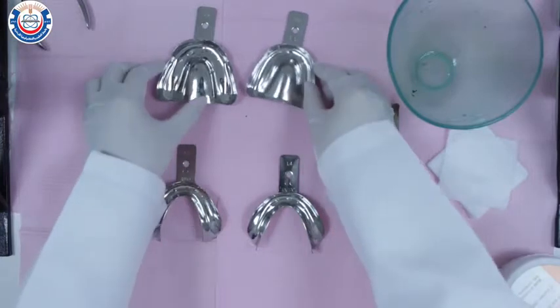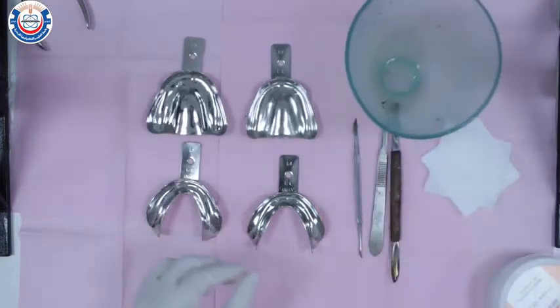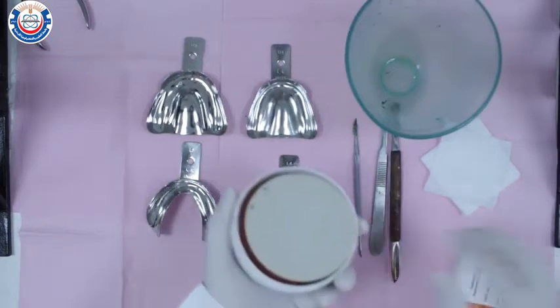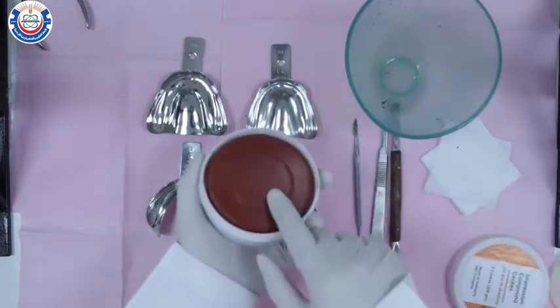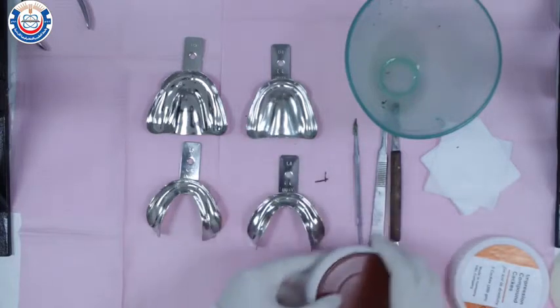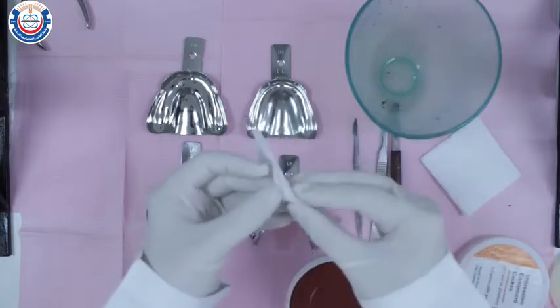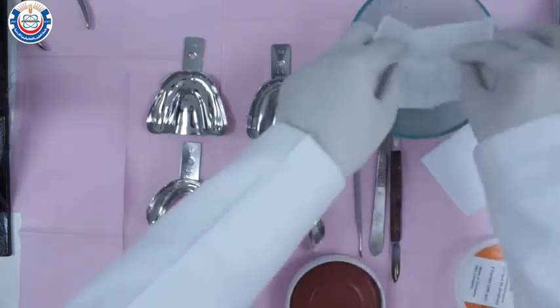To make a primary impression for an edentulous patient using impression compound, you're going to use metal trays, impression compound cakes, a rubber bowl, and some Vaseline. Place 8x8 gauze inside the rubber bowl to prevent the material from sticking to the inner walls of the bowl.